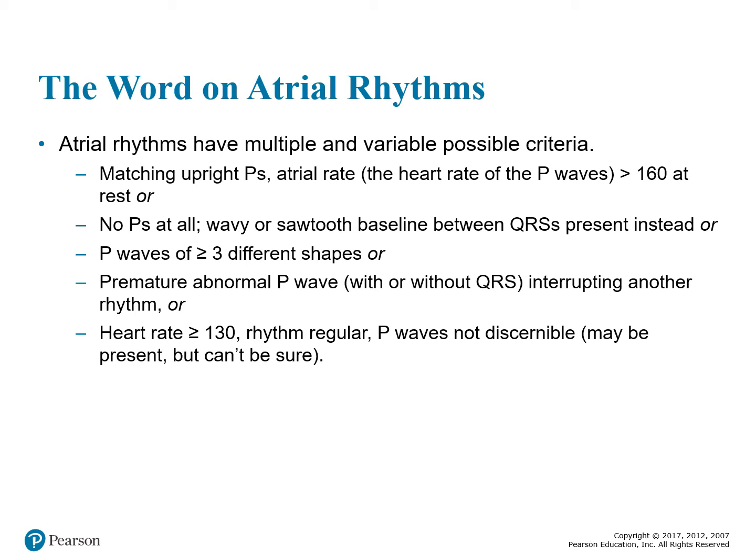Atrial rhythms can have multiple or variable criteria.